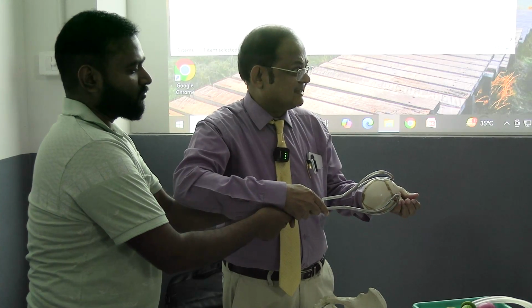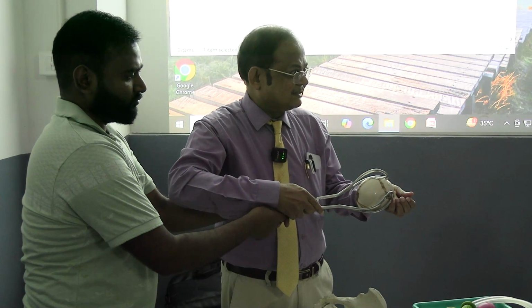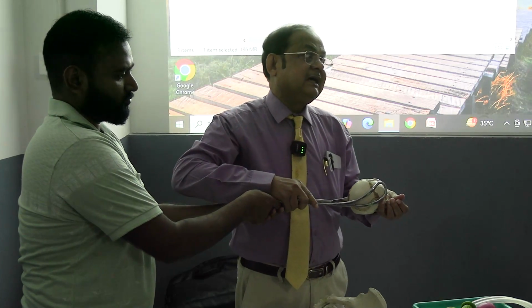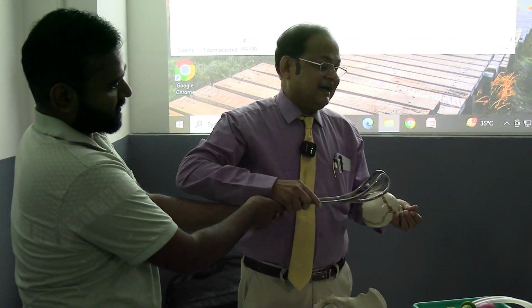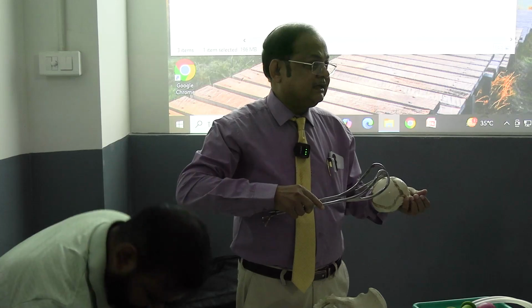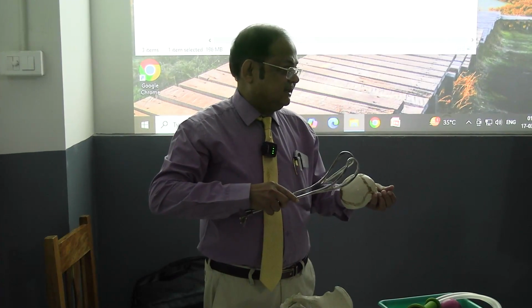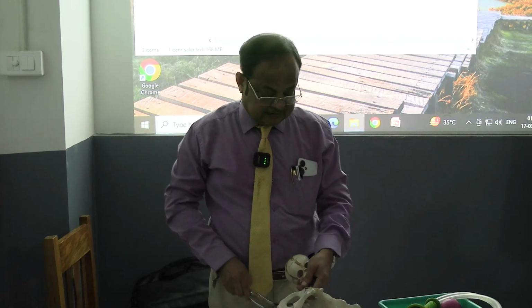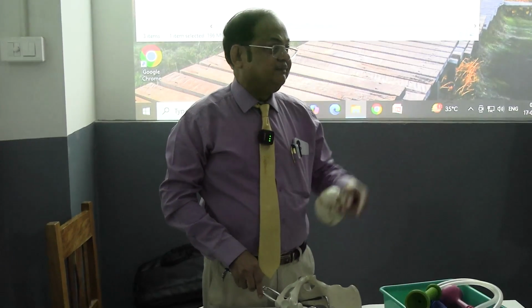There is injury to the fetus. So this is called cephalic application. Another is the pelvic application, where you ignore the fetal head and apply like this. So which one will be better?